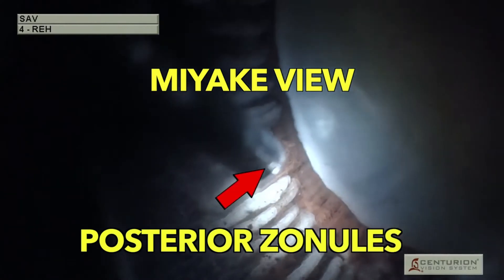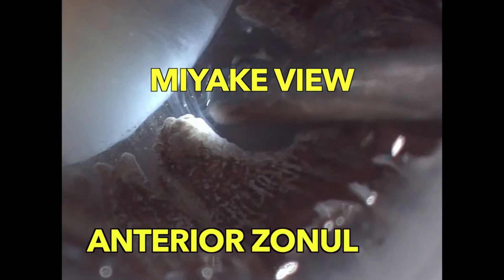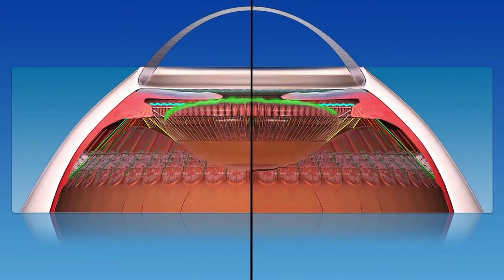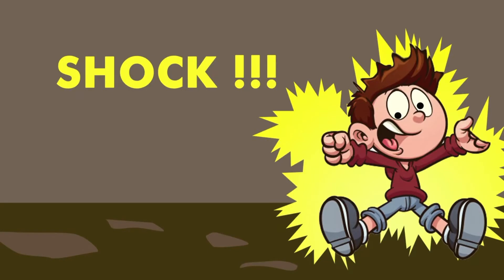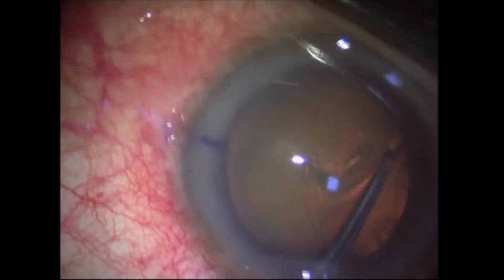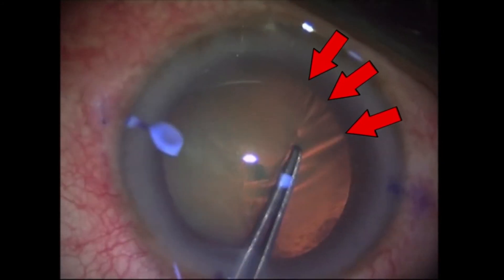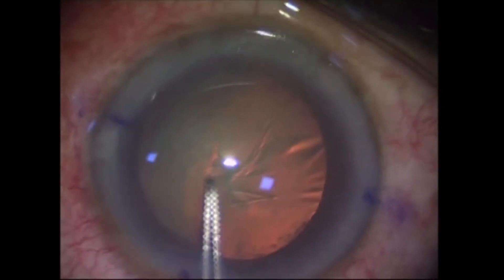Let's demystify the zonular weakness and sing some jingles for the capsular wrinkles. What if only the anterior zonules are weak? Then, my dear friends, you all may be left shell-shocked. During capsular rexis, notice the wrinkles of the anterior capsule beyond the rexis margin. These take place because the anterior zonules are weak and there is no counter-traction.